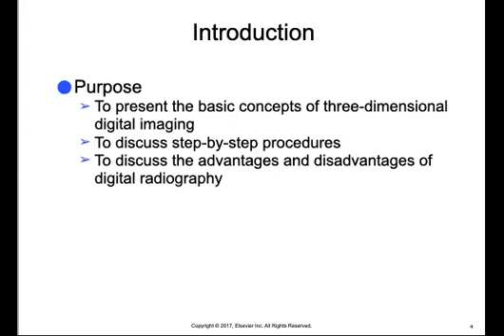So all of the images discussed in the previous chapters of this text have been two-dimensional, and dental imaging is no longer limited to two dimensions. Three-dimensional imaging is now available. In 1999, a technology called cone beam computerized tomography, or CBCT, was introduced that allows for the viewing of structures in the oral maxillofacial complex, or the jaw area, in three dimensions.